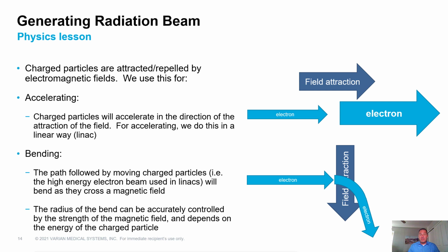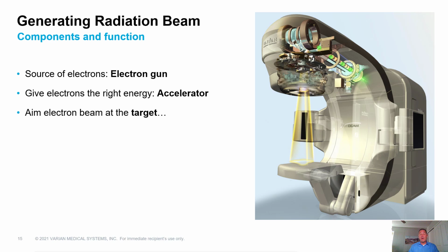Electron acceleration employs a source of microwaves that act as a carrier that propels those electrons down that waveguide. And Varian uses two systems. We use a radio frequency generator that creates input microwave, and we're back to a klystron that amplifies that input wave to a usable power range. Okay, now we're getting to the exciting part.